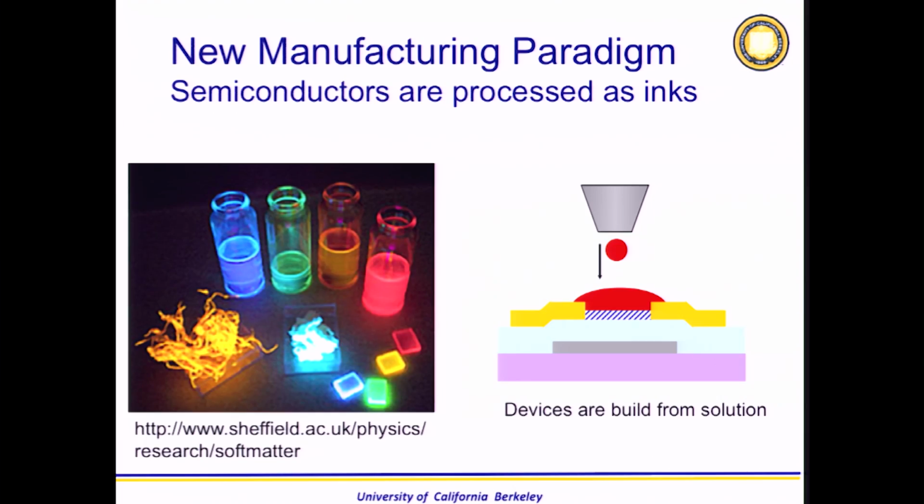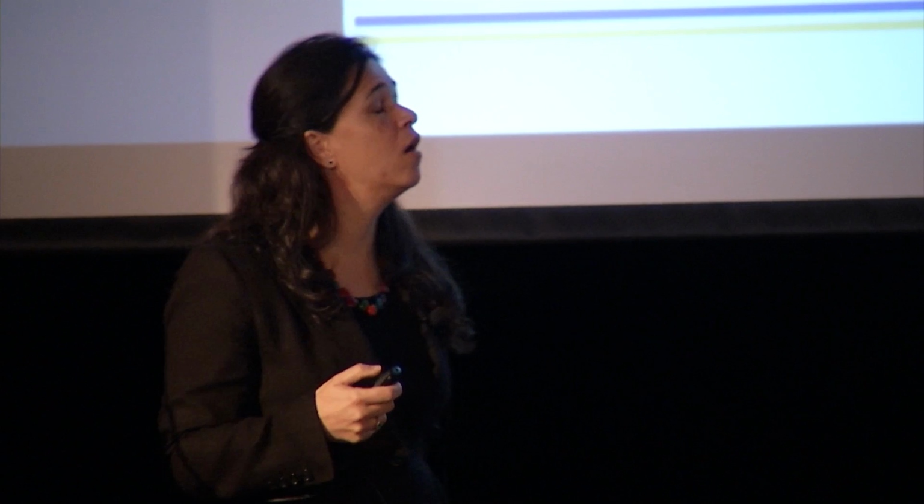In terms of manufacturing, these materials are also revolutionary because now you can think of your semiconductor as an ink. In fact, this is a selection of light-emitting semiconductors, and you can see here the powder being very fluorescent. But when you make a solution out of it, it also emits light, and this is what we use in order to make these devices that are truly bright and a very true color.